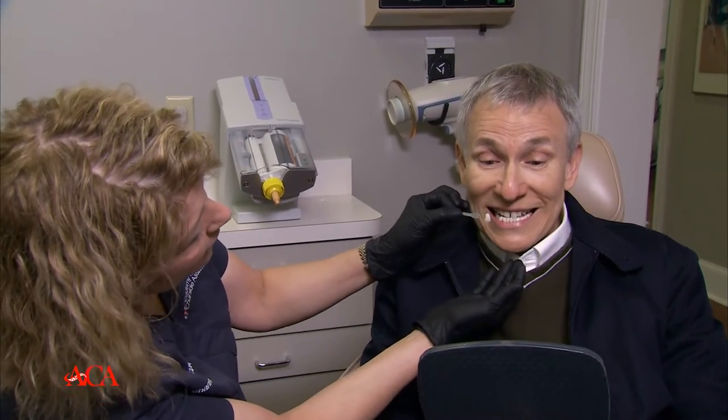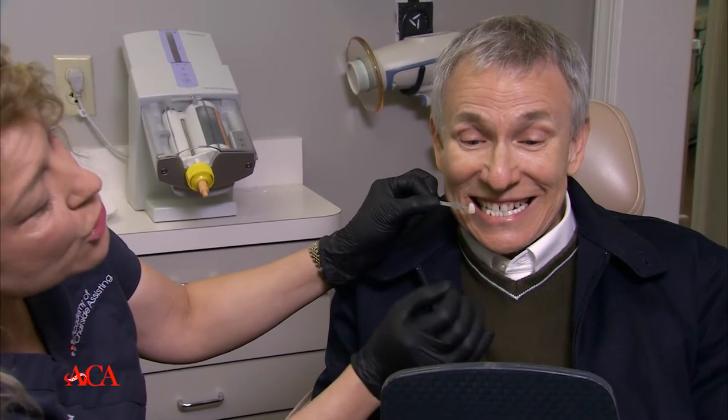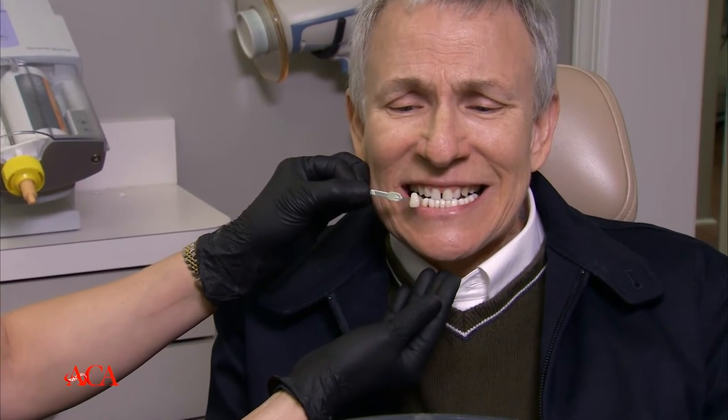When you smile really big, you have beautiful restorative work on the lower and your teeth on the top are so close to that. You just need to lighten a little, and we're choosing a whitening option that's going to be easy to utilize and maintain. You're a little lighter than A1, and you are the perfect candidate for the Ultra.